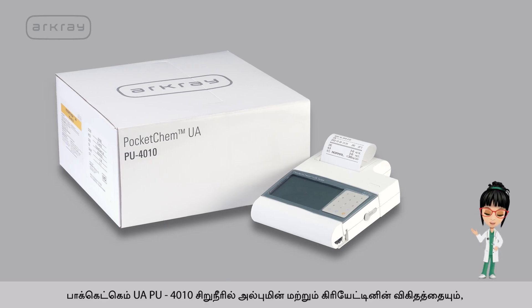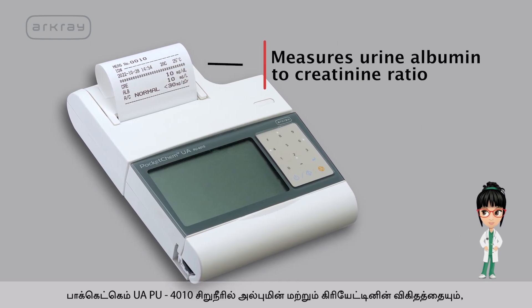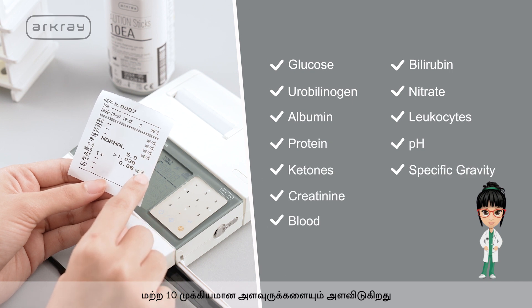Pocket Chem UAPU4010 measures urine albumin to creatinine ratio and 10 other important parameters.